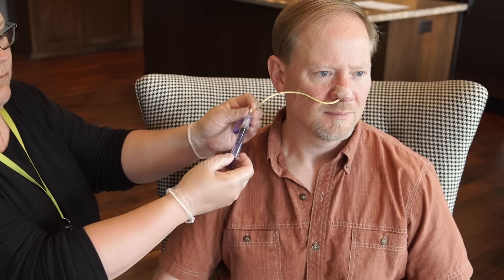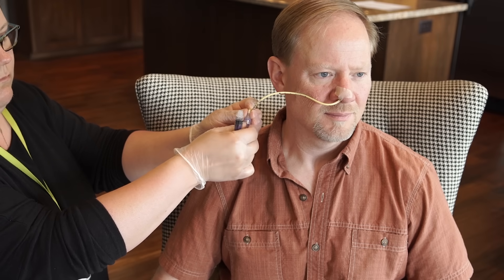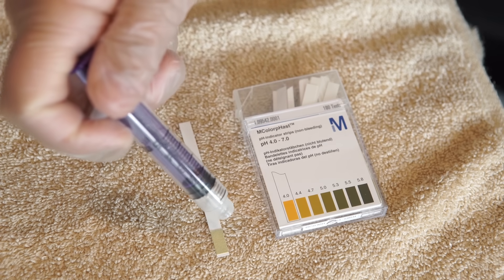If you are using a nasal or oral feeding tube, check tube placement. For a refresher on how to check the placement of an NG tube, click here to watch the video.